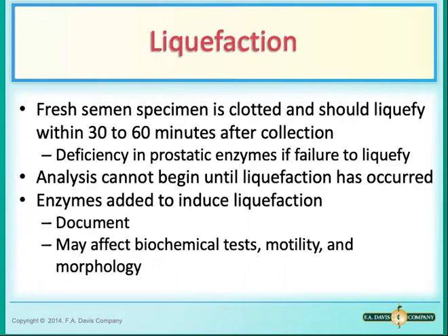Liquefaction is another parameter that is evaluated when we're evaluating all of the parameters in the semen analysis. A fresh semen specimen is clotted and should liquefy within 30 to 60 minutes after collection. So we need to record the time of collection when we are evaluating for semen liquefaction. If your sample fails to liquefy within 60 minutes, that could be caused by a deficiency in prostatic enzymes, and that definitely has to be reported.